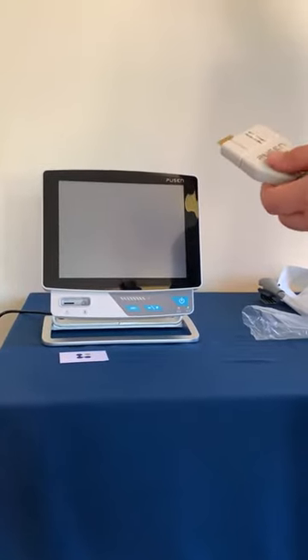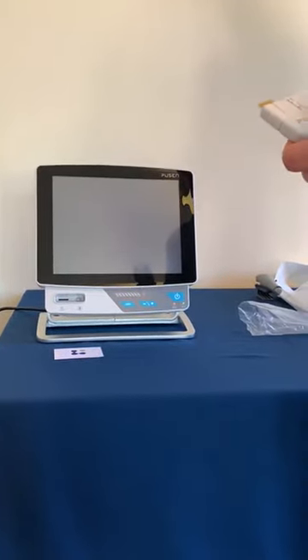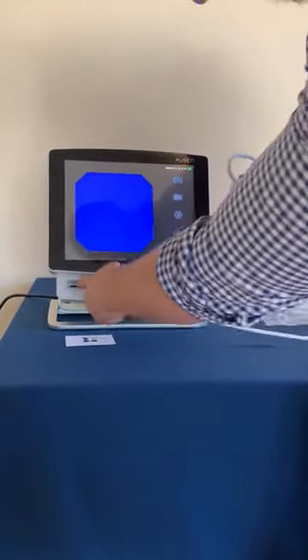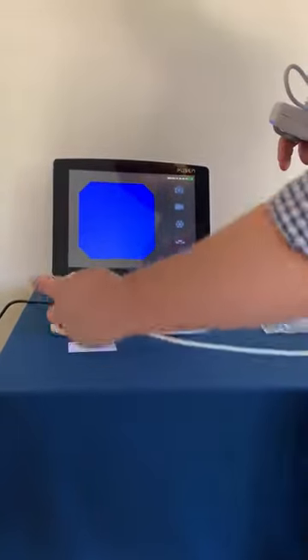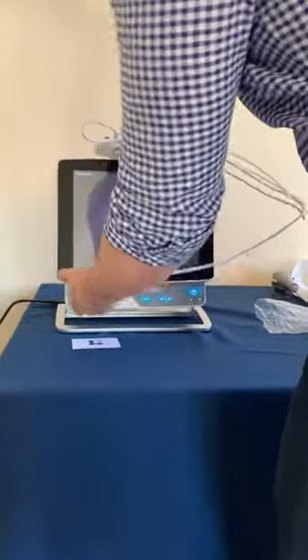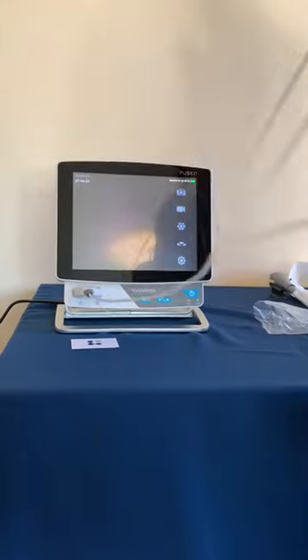This could obviously be done before you open the scope as well — it can be left on standby at any time. Take the device and plug it in with this at the left hand side. Once it plugs in, we're now ready to scope the patient.